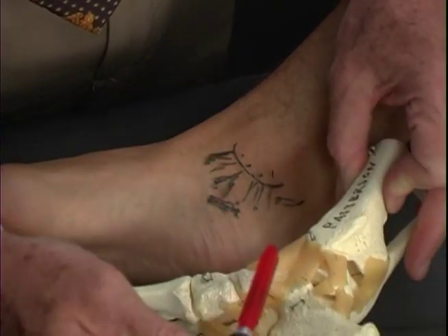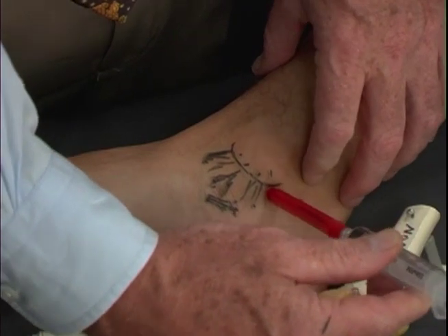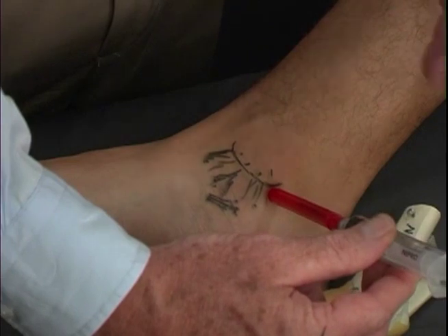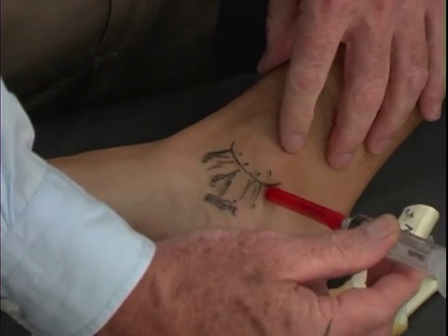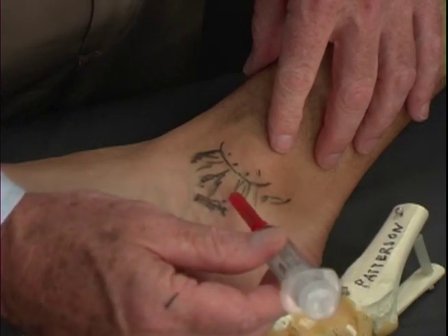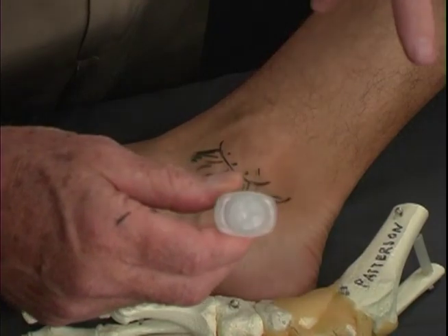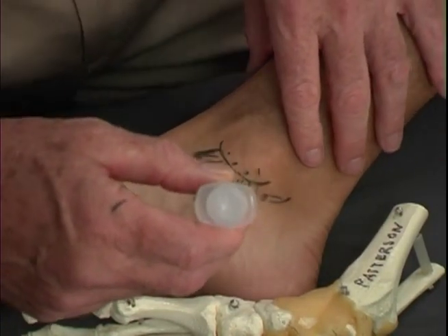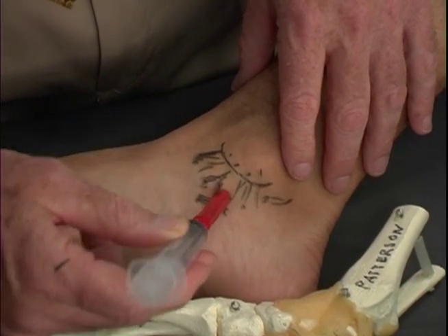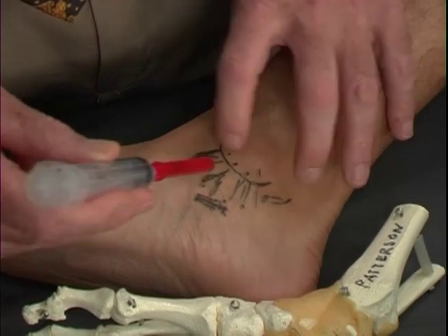We then focus on the other areas that we have marked, and again, often noting that there are tiny areas of bony prominence where the tenderness is that we will be able to hit with our needle. Coming around, we don't worry much about the nerve and artery in this area because we're on bone below the nerve and artery, and so we really don't have a problem with aspirating or needing to aspirate in this area.